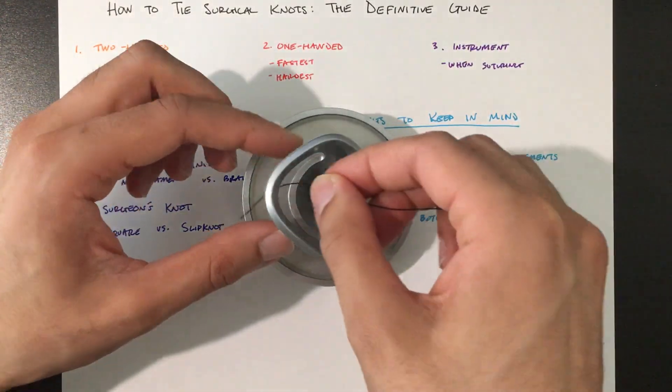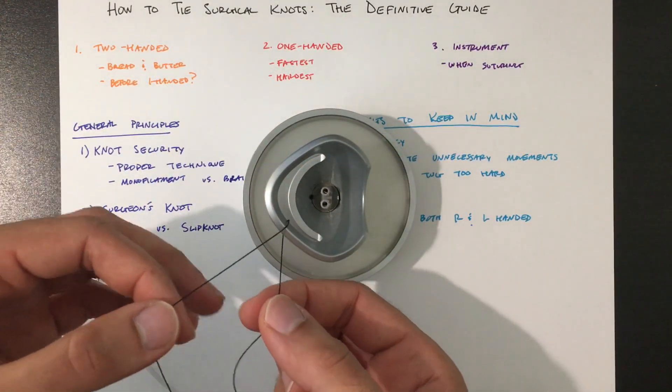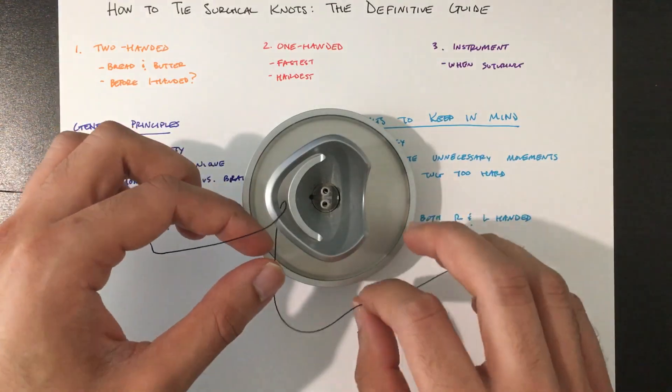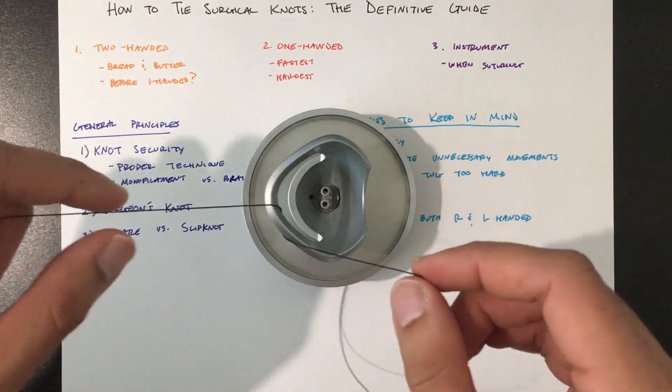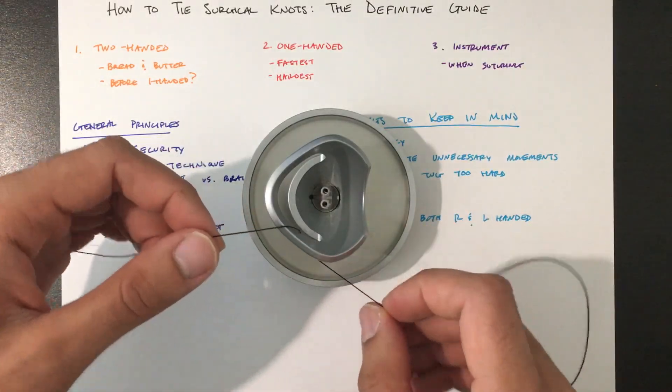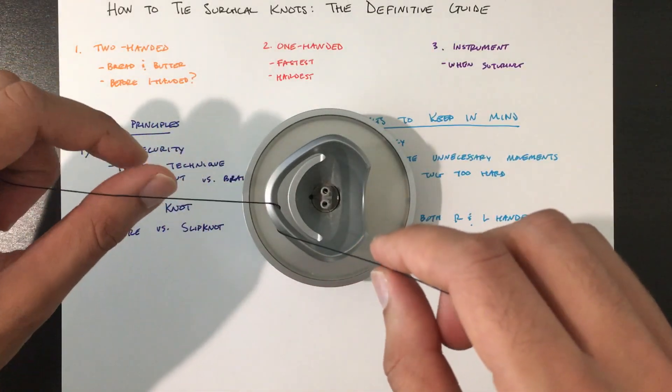So first I'm going to show you a two-handed. So what I do to make sure I start off square is actually criss-cross and the bottom one goes to the right, the top one goes to the left. Figure out what system works best for you. This just helps me throw the first knot square.